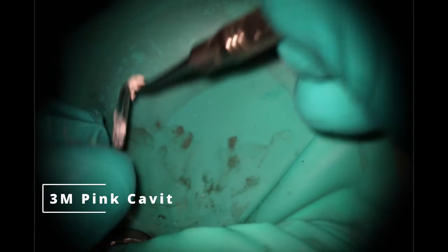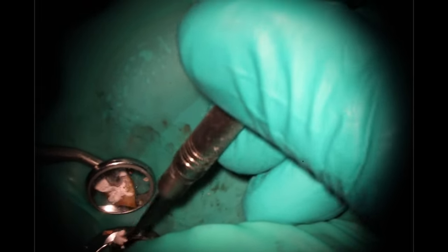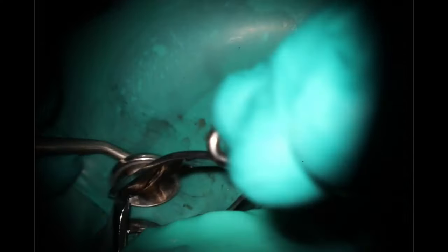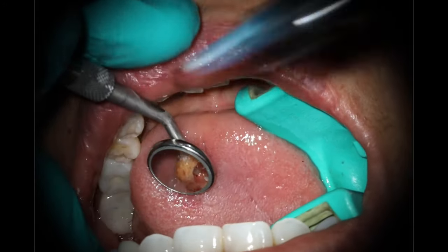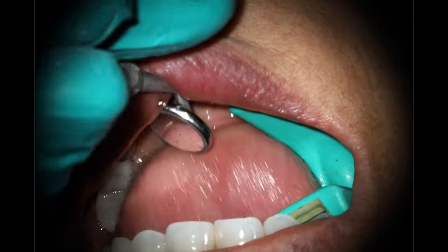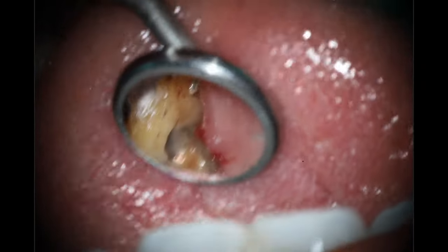Two reasons for this: number one, it's easier to remove; and number two, when you do remove it, it doesn't get caught on the bur and destroy it like cotton would, making that horrible awful sound. So I have a pet peeve against both IRM and cotton pellets. And you saw me just commit a cardinal sin — I took the rubber dam off before we put that on. When's the last time you knew of a general dentist who placed the core without a rubber dam? Like it's all the time. So I'm not too concerned here. But what I am concerned about is the limited amount of tooth structure remaining — that's where that tooth is going to fail right in that furcal area.